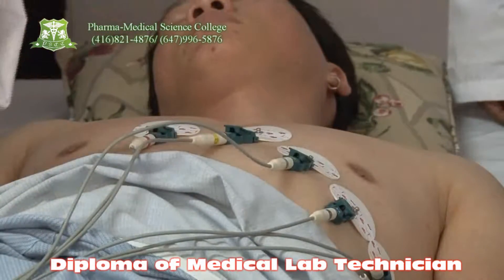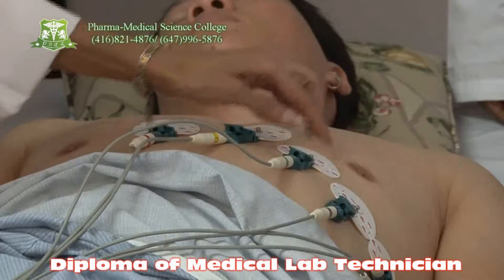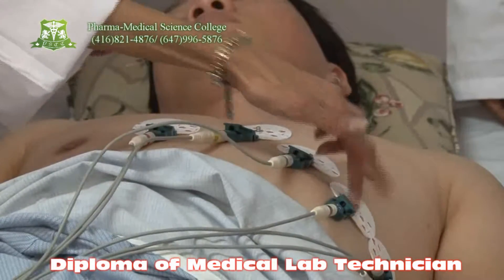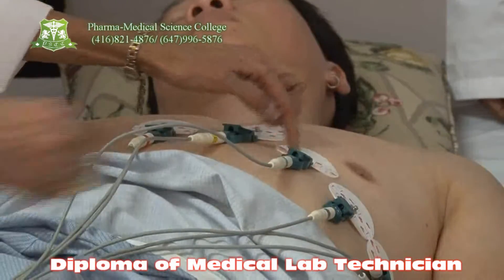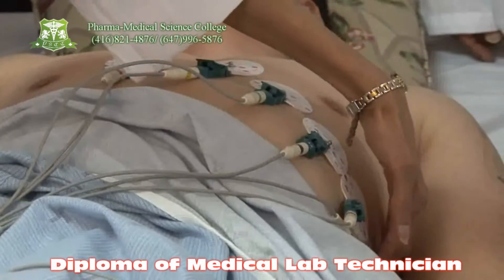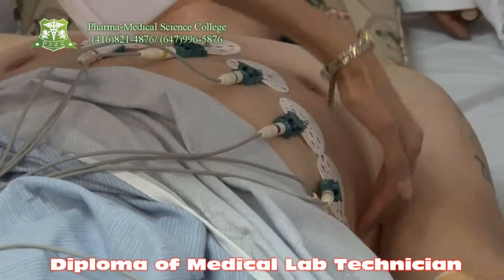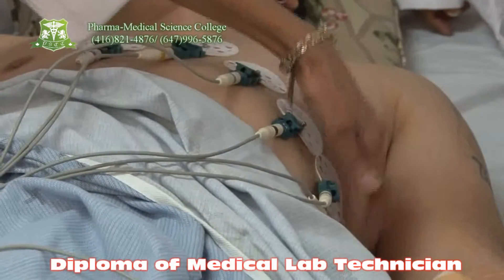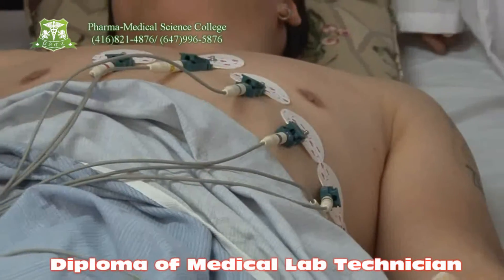Below the nipple, the easy way to find the position of the electrode — below the nipple we put the number four electrode. Between electrodes two and four, you locate your third electrode. Then locate your axillary line, which is the mid-axillary line under the armpit — that's going to be the number six lead. Between four and six you now locate your number five electrode.